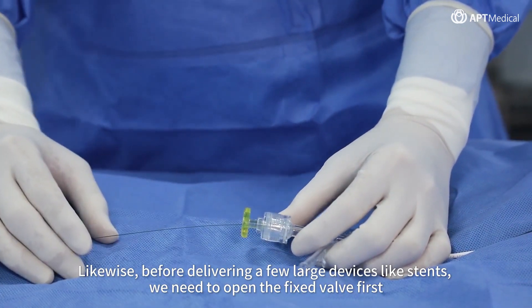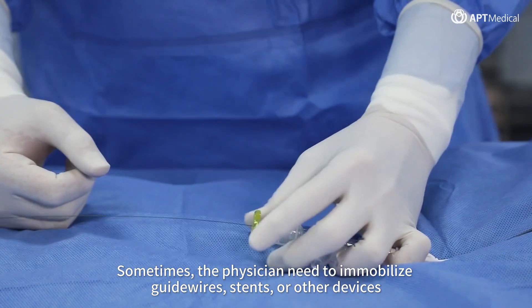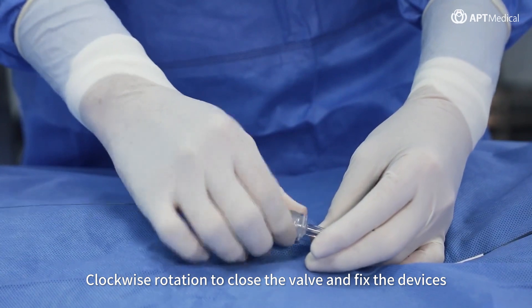Likewise, before delivering large devices such as stents, we need to open the fixed valve first. Sometimes the physician needs to immobilize guide wires, stents, or other devices. Clockwise rotation closes the valve and fixes the devices.